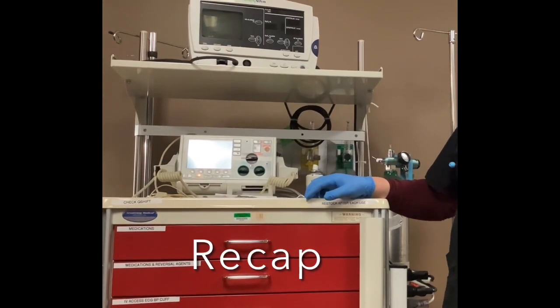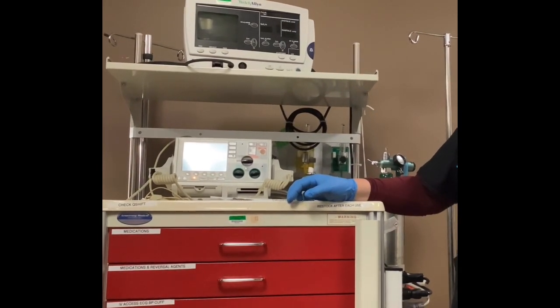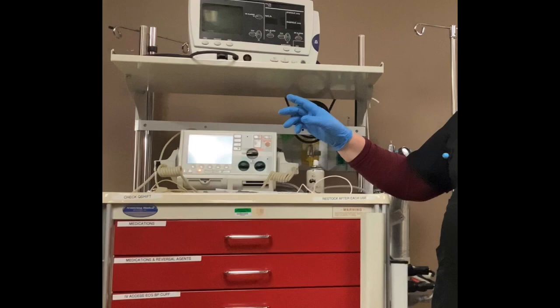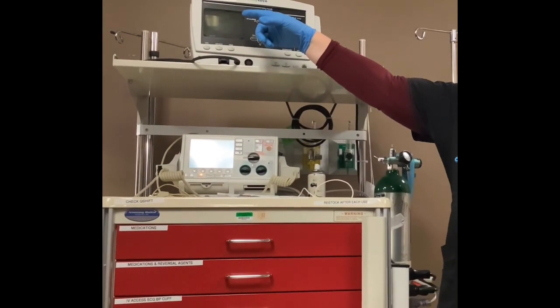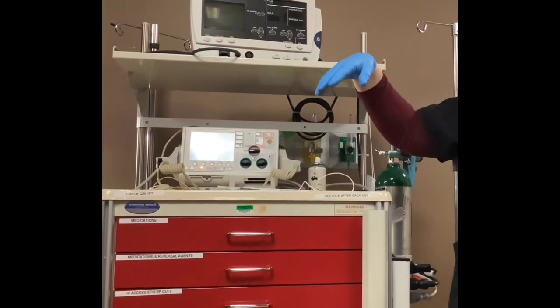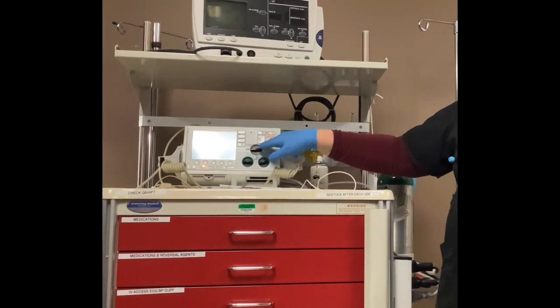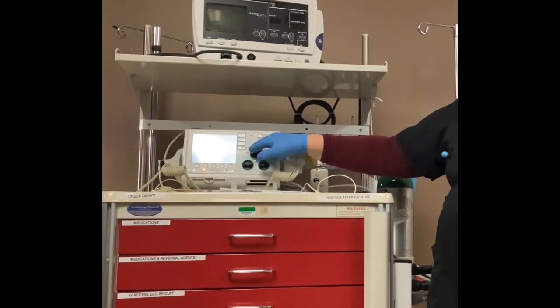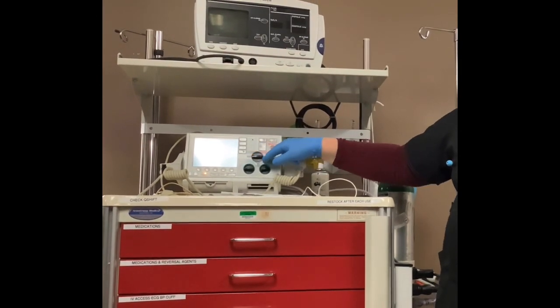So 3-lead, put on the monitor. 12-lead, checking for heart function. The AED, for patients found down outside of a medical facility, checks for a shockable rhythm so we can shock them. Defib is for a rhythm that doesn't have a pulse, VFib or VTAC. Cardioversion is for a rhythm with a pulse, and you must sync to it. So those are the differences you'll need to know.